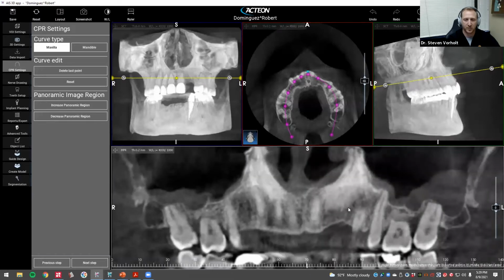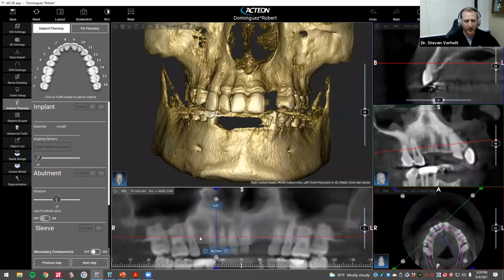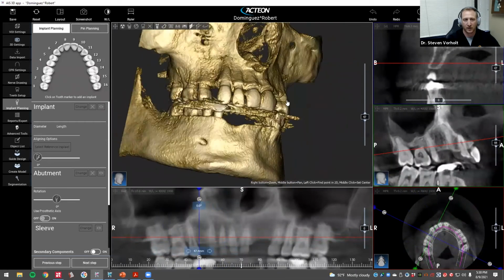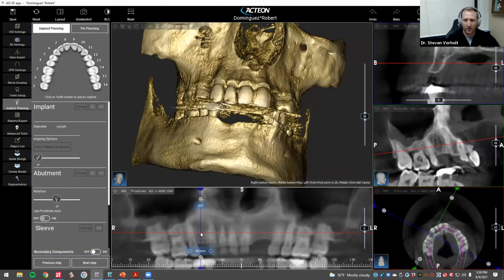So now I have this panoramic reconstruction from my CT. I'm going to thicken this so it looks a little bit more usable. And this is the view that we had seen on the PowerPoint slide. Okay, now we're going to go forward to implant setup. And I can scan through. This is the screen I prefer to have. I have a panoramic reconstruction. I have a 3D rendering that I can kind of look at the gross anatomy. And then I have the tangential slice in the upper right. And those are the main things I'm going to be focusing on today.